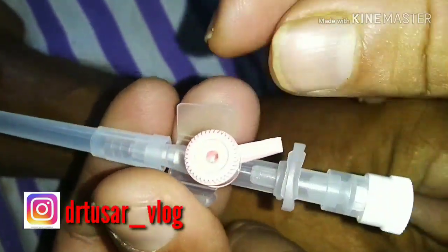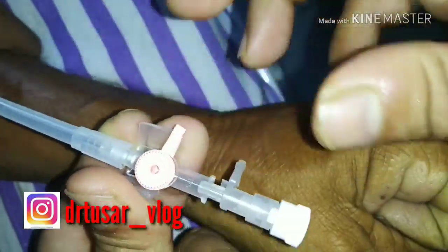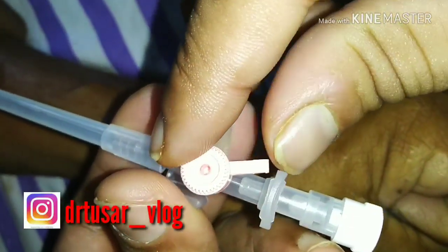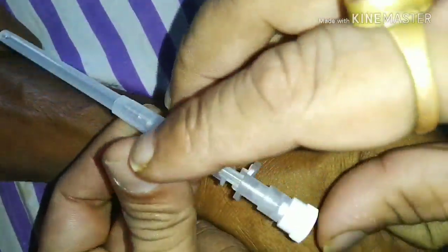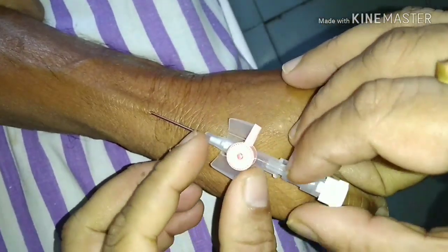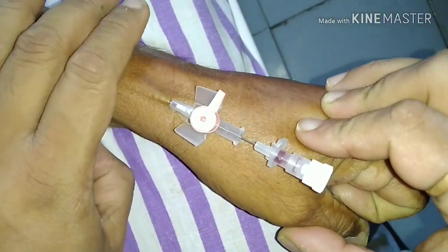Today we will learn how to put a venflon very effectively and with less complication. You must rotate the cam to the right side, because it will not accept passage otherwise. When you insert the venflon and pierce the vein, wait for the blood to come into the chamber, then withdraw the needle a little bit and push it in effectively and smoothly.